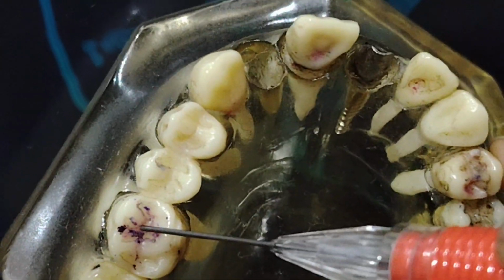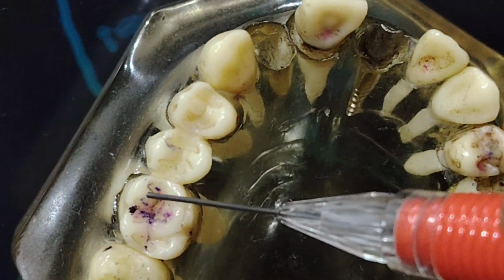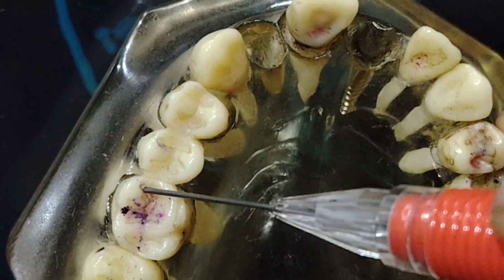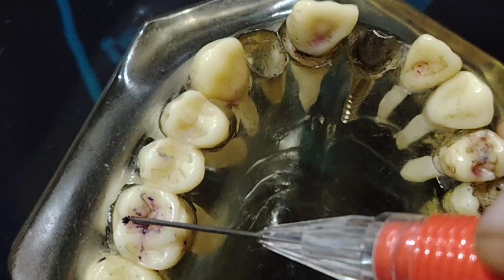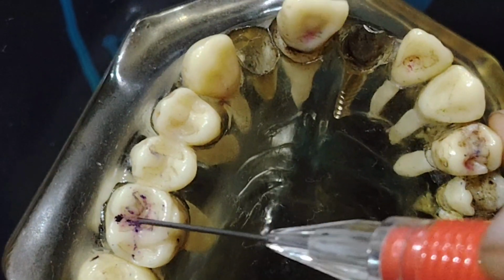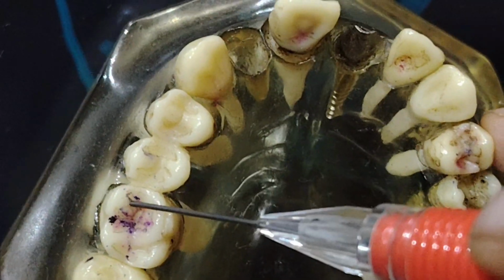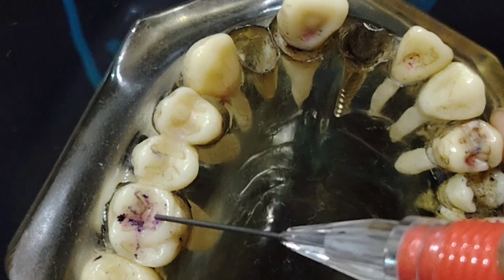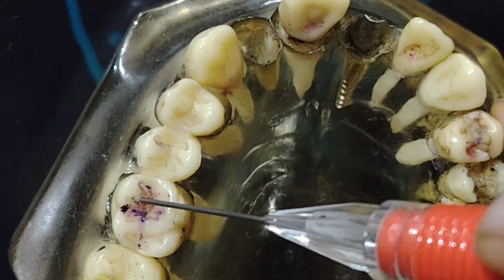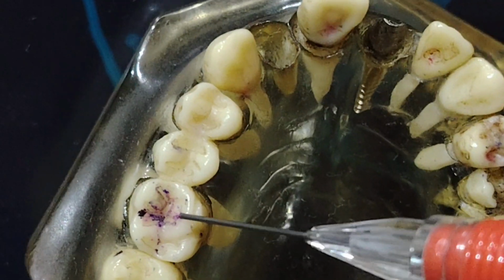From this ditch we are going to extend this way, and a little buccally. This is the area where we will find our canals. Distal most probably here, mesiobuccal here, and palatal here. These are the most probable areas to find our canal orifices.